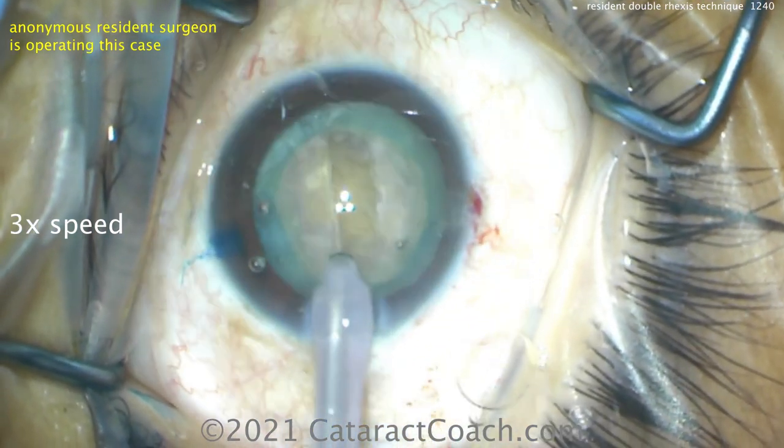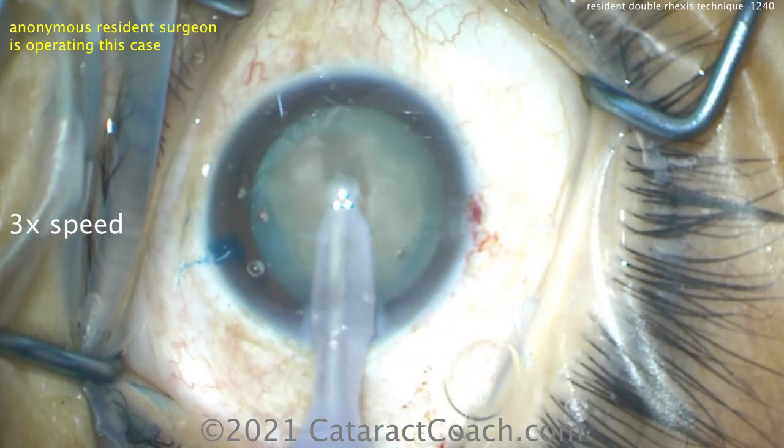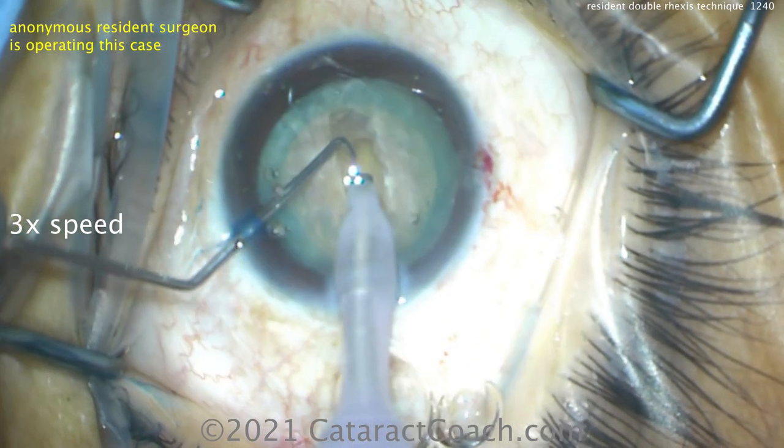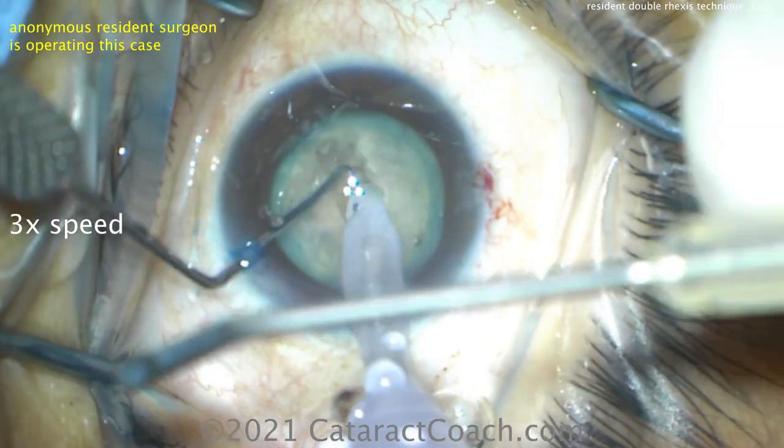Nice grooving there, nice central grooving made. Notice how the angle's correct. Remember, the cataract's like an M&M candy — thicker in the middle, thinner in the periphery. Let's see the split.